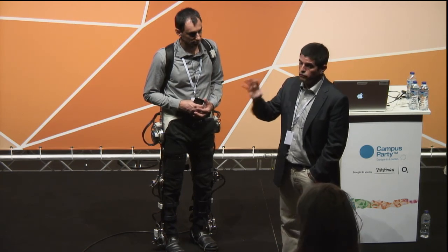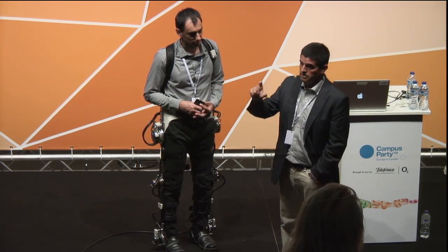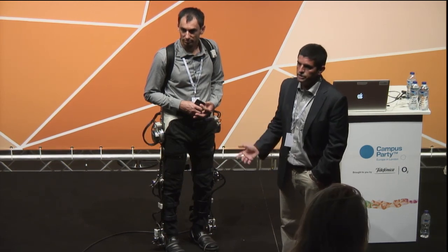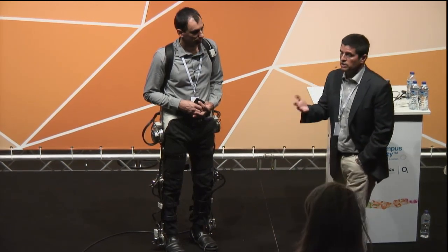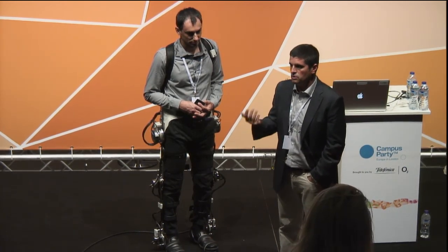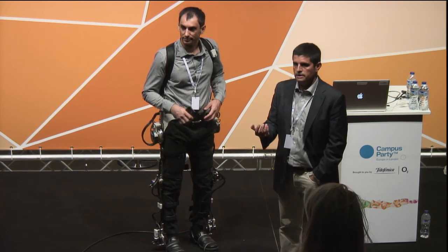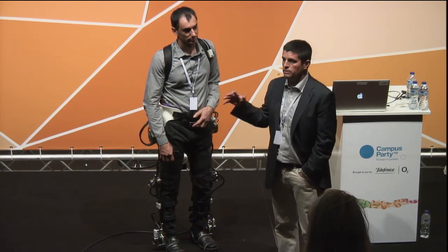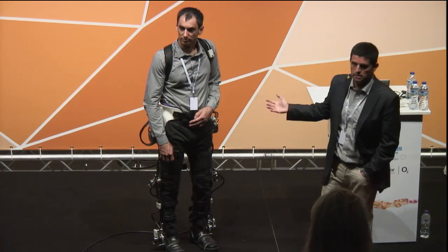in the control software, you can of course limit the range of motion for a particular patient according to the condition. As you said, one of the therapies that, for instance, people with stroke will be subject to is a therapy to increase the range of motion. So you can integrate that in the controller of the system like this.